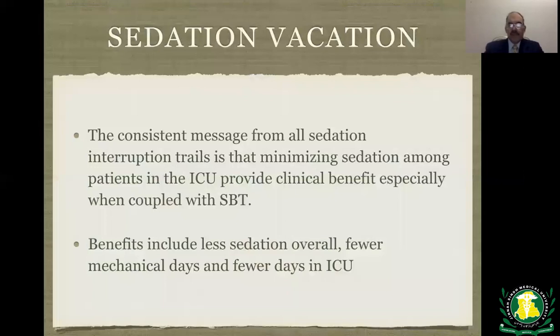Sedation vacation. All these patients, other than the few that I mentioned where you need deep sedation, the sedation should be interrupted every day and let the patient be awake. For assessment, the consistent message from all sedation interruption trials is that minimizing sedation among patients in the intensive care unit provides clinical benefit, especially when coupled with a spontaneous breathing trial. Benefits include overall less use of sedation, fewer mechanical ventilator days, and fewer ICU days.